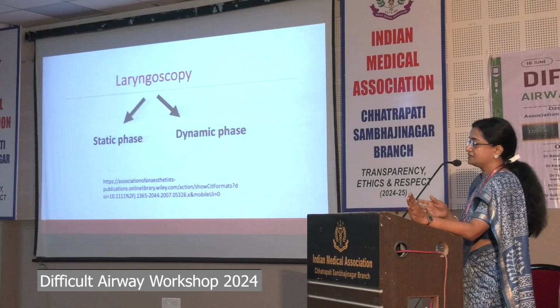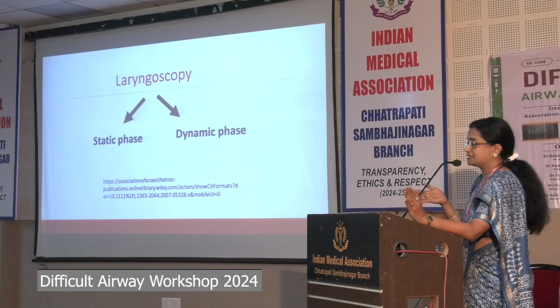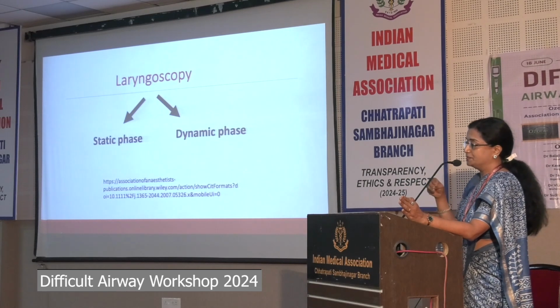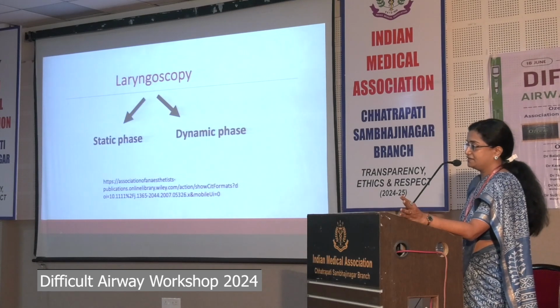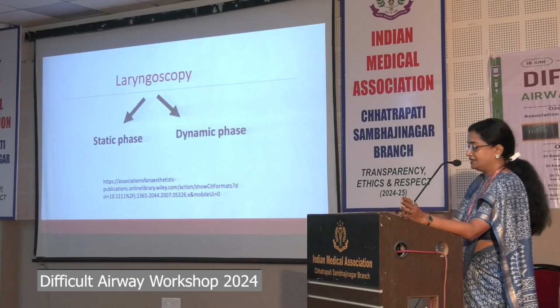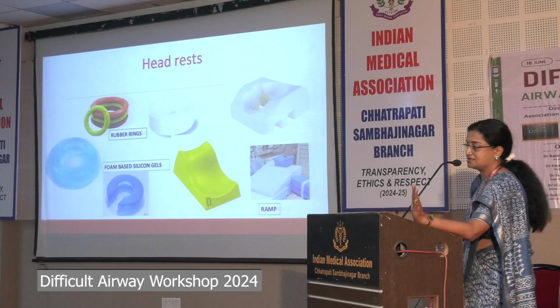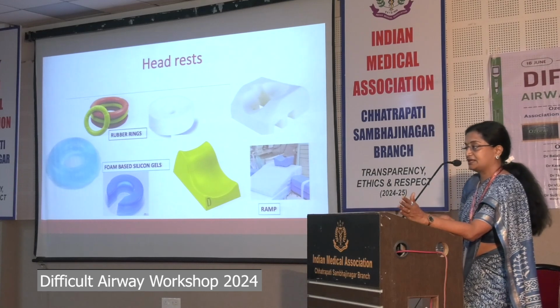So laryngoscopy is divided into two phases, the static phase and the dynamic phase. Whatever you do in the static phase improves your intubating attempt in the dynamic phase, and improves the success rate. So what are the static phase elements? That is pre-oxygenation, positioning, apneic oxygenation. Accordingly you keep your devices ready. Any of these headrests are also airway equipment devices, because these are very important and mostly neglected things in the static phase.